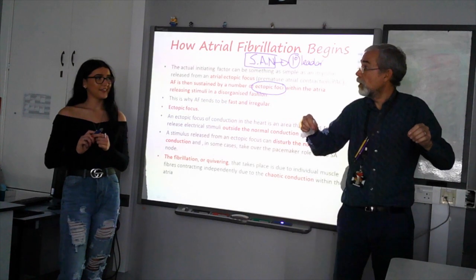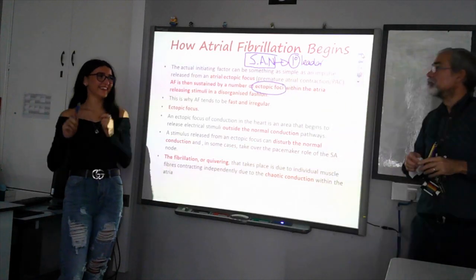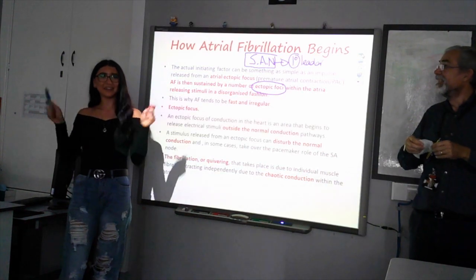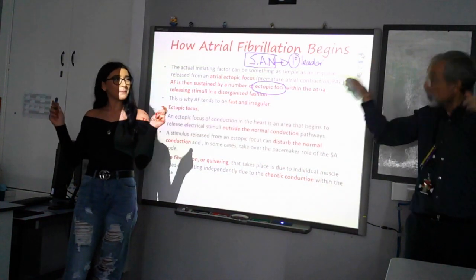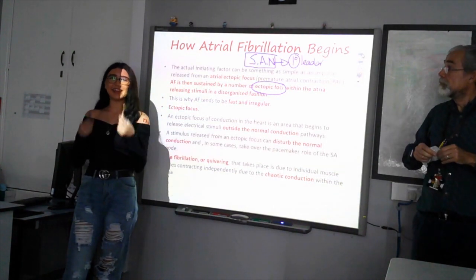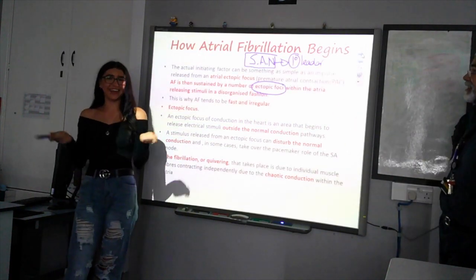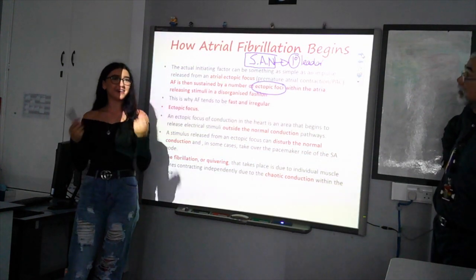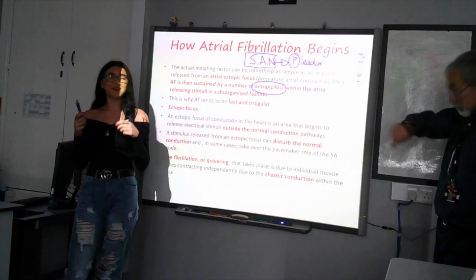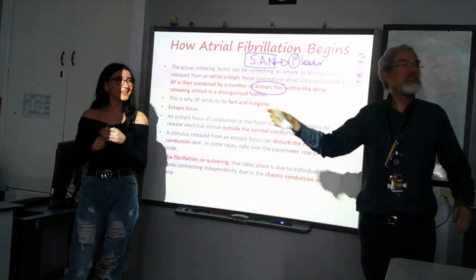And you're going to go P, Q, R, S, T. And P, Q, R, S, T. Keep going. P, Q, R, S, T. Do we get the idea?